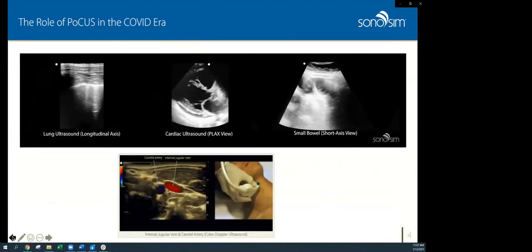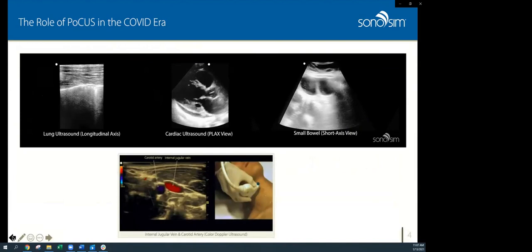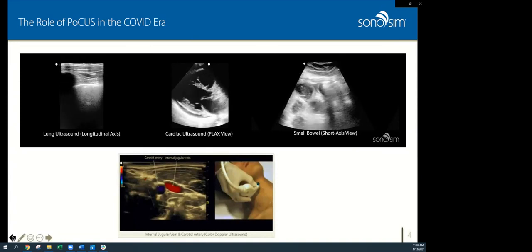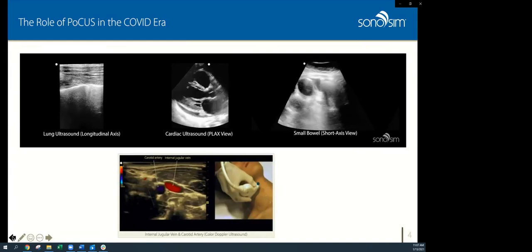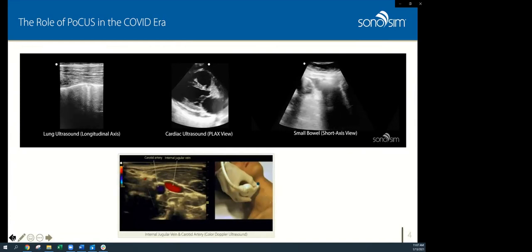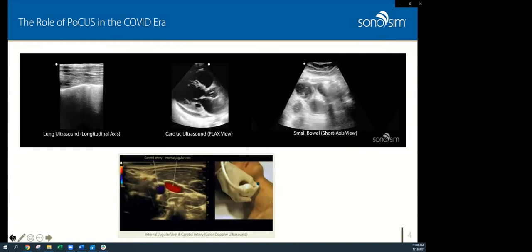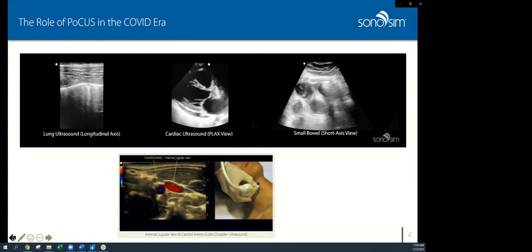So, what's the role that ultrasound has played in the COVID era? And what other benefits does ultrasound provide? So one of the major things that ultrasound really facilitates, so I've been in the ER 3 out of the last 4 days, and when patients come in, many times they have undifferentiated complaints. And when they come in with undifferentiated complaints, helping sort through the differential diagnosis of shortness of breath or weakness or abdominal pain, or when there's a critically ill COVID patient that need to do a procedure. These 4 slides really illustrate 4 different general ways that point-of-care ultrasound can really facilitate patient care.